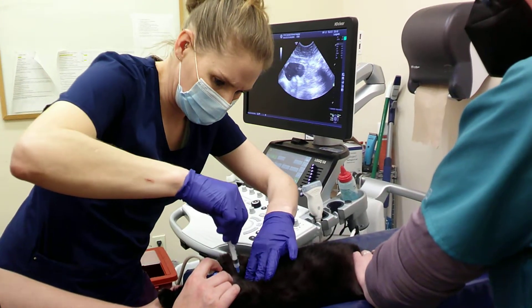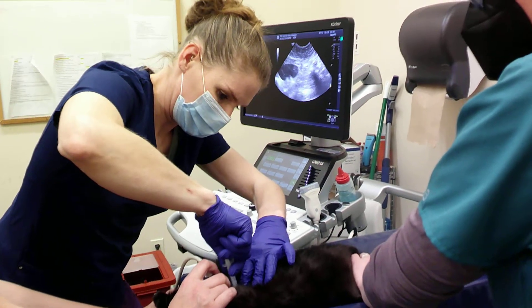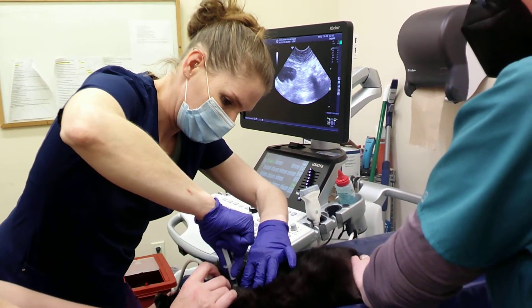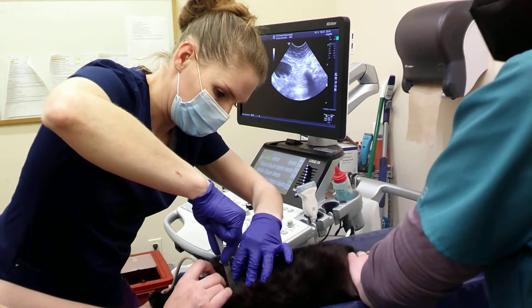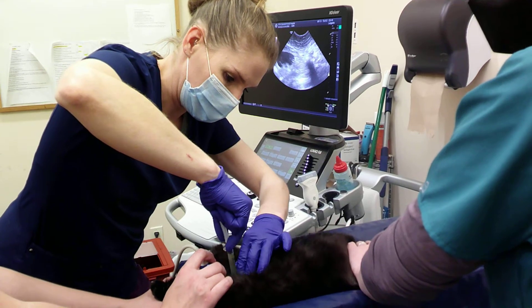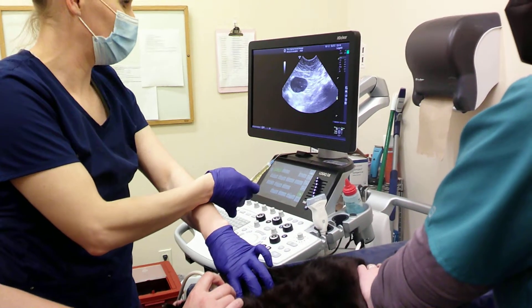We've got our 22 gauge needle. We're going to insert it into the bladder. Pull back and get our sample. Then we need three cc's. And then I'll pull off the site to prevent any bleeding.